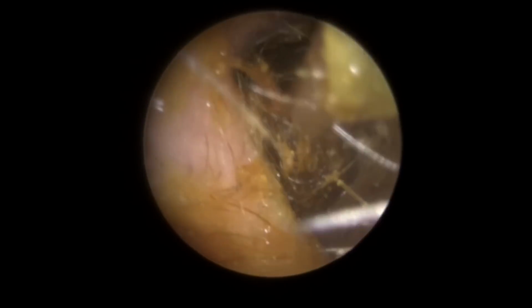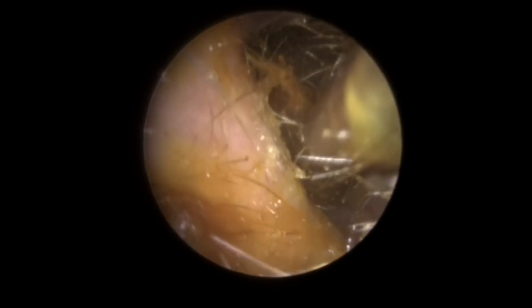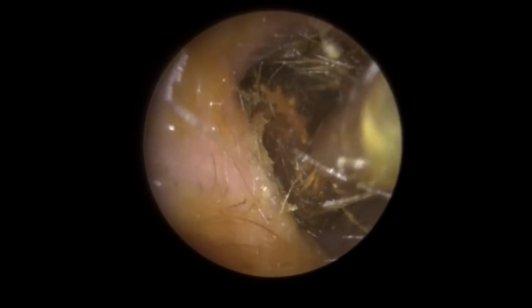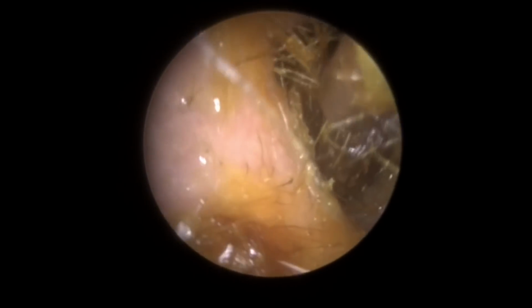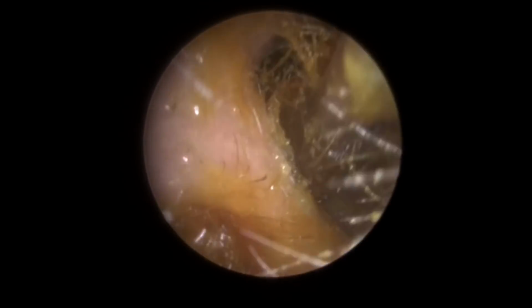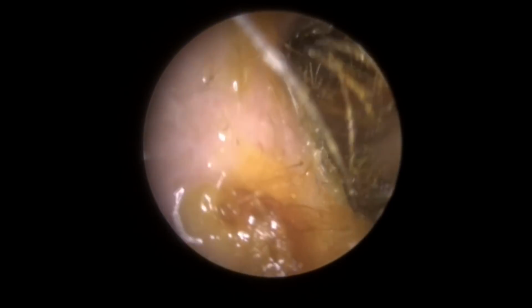Just trying, there we are, so you can see it's lifted up, and because we've broken that front section we can now lift and pull at the same time. There we go. Trying to get a good grip on this. What I don't want to do now is push the Jobson horn in at this point, because it'll push it back in. If we can pull it out a little bit further, there we are.